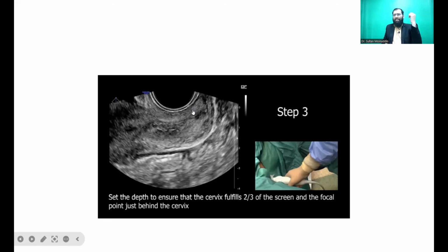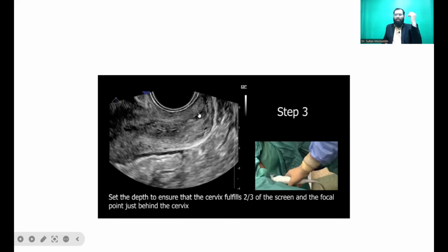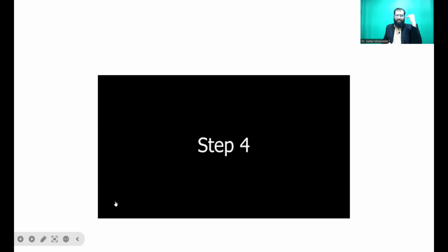Ureter and iliac vessel differentiation. So how do you differentiate? This is a very good question which one of the students has asked. I will pause here. So the question is, in a normal ultrasound without Doppler, can we trace the iliac vessels? Yes, you can. Even without Doppler, you can trace the iliac vessels. So how? I'll show you one image. This is a very good question, and it helps to solve many problems in ultrasound.